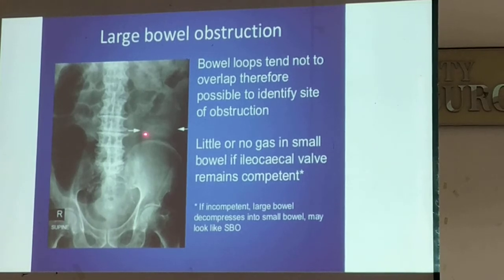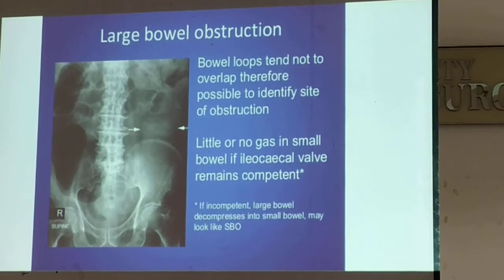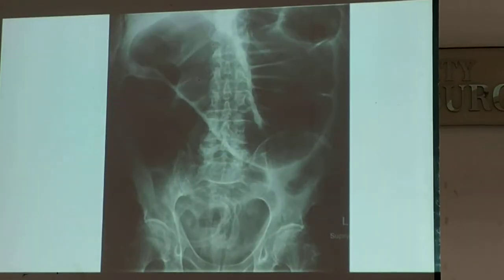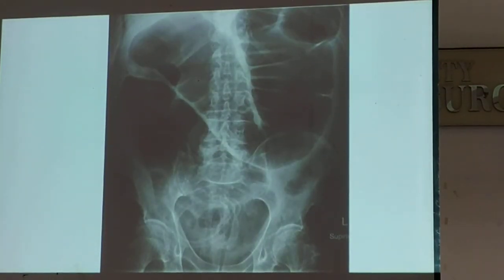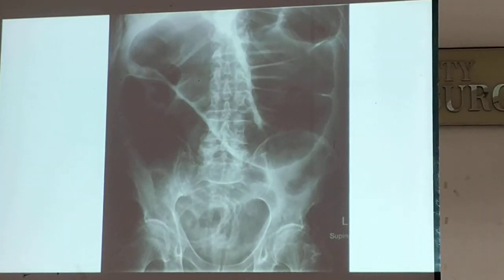This is your large bowel. The diameter is bigger — it is 5 cm. In obstruction, it goes beyond 8 cm. So you would see what looks like a megacolon.